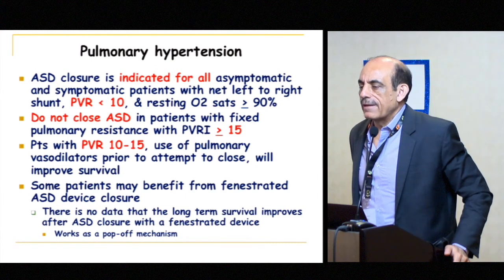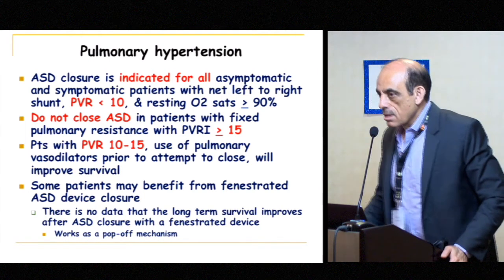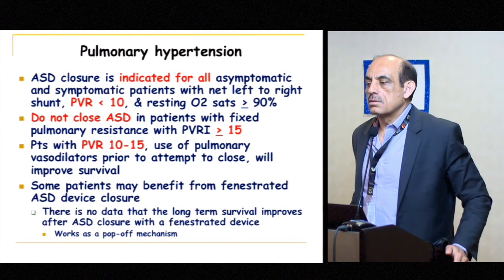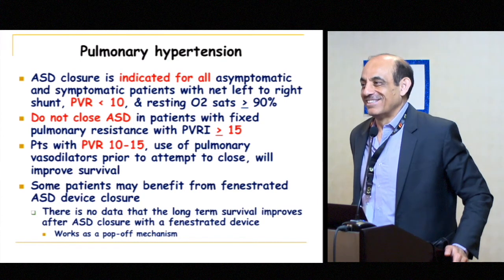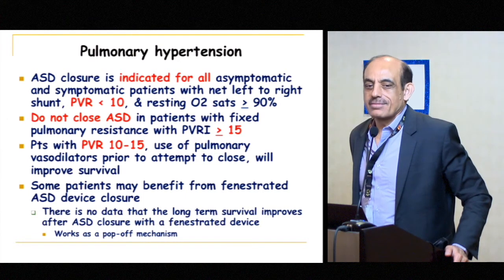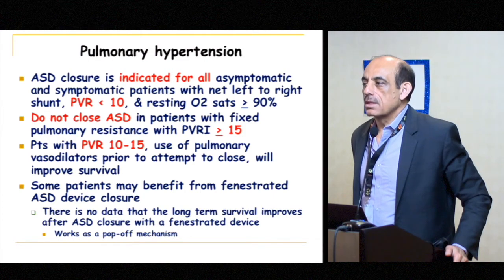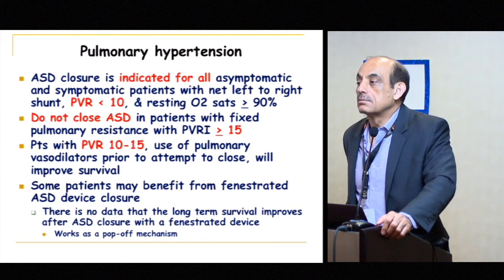The 3D image typically will give you, I wouldn't have said average, it typically gives you the maximal diameter of the elliptical shape that you're trying to obtain with your balloon size. I balloon size every case. But if you look at your balloon size compared to the 3D image, it's the longest diameter that seems to match closest to the balloon sizing. Many people who use 3D on a regular basis tell me that's the diameter they use when they're not going to balloon size, because it comes closer to the approximation of what balloon sizing gives you.